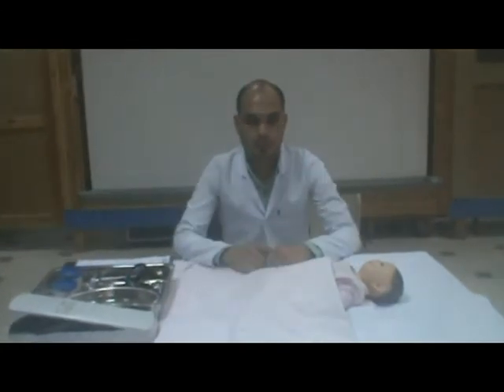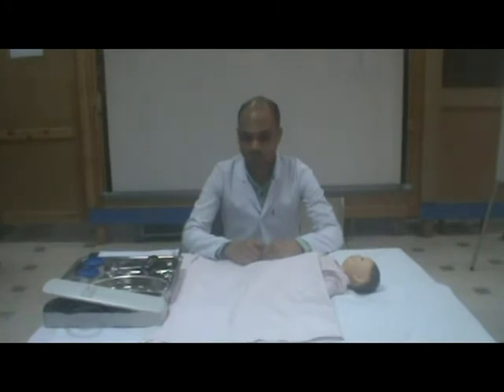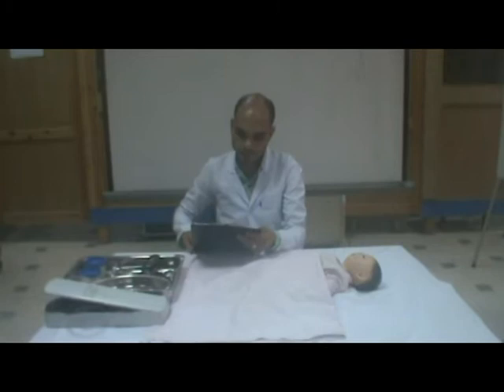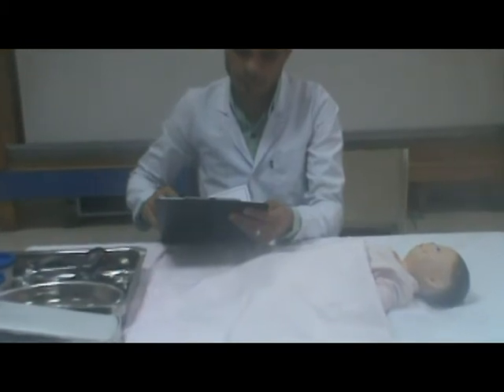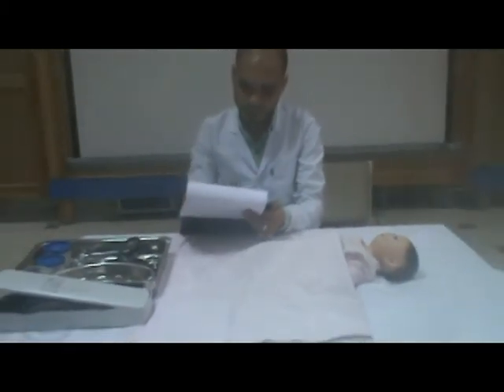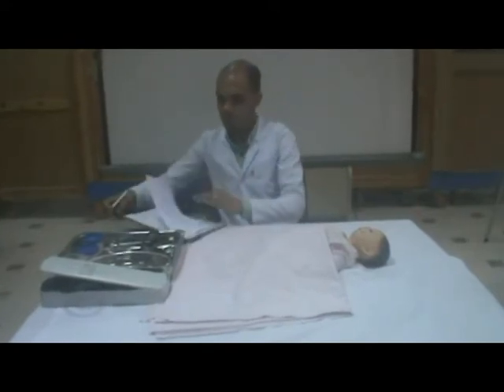Apical pulse. Steps. Number 1, review the child's previous heart rate when available to provide a basis from which to make comparison. Number 2, determine whether the child is taking any medication that may affect heart rate or depth to obtain an accurate reading. Number 3, prepare all needed equipment to save time and effort.